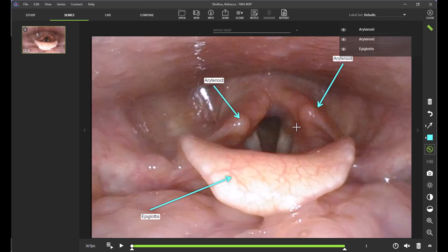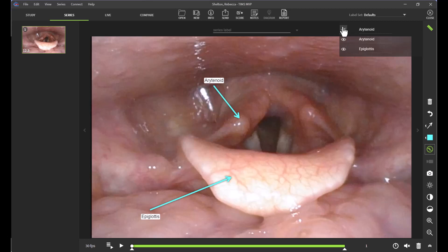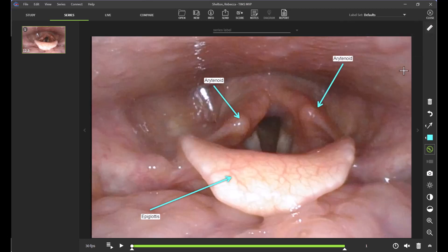As you can see, I now have my three sites labeled. I can easily hide these from view by clicking the eye icon, which does not delete them — it simply hides them from view. And by clicking the eye icon again, I can re-visualize these telestrations and annotations.